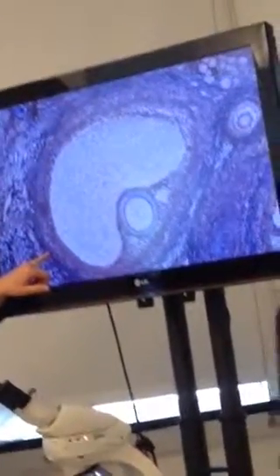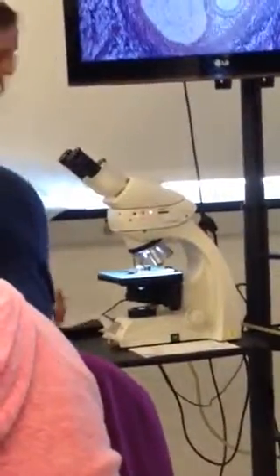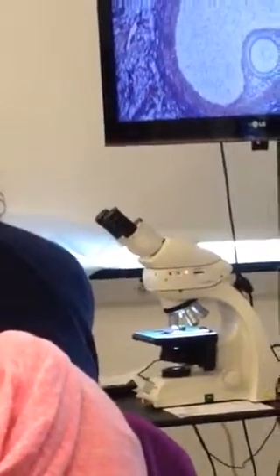Let's see where I left off. Okay. So I'll leave this up here. If you want to go back to a different part of the slide, let me know and I'll put it back. But I'll leave this for you to take a picture. Sperm. Well, I'll put the sperm up in a few minutes, or should I just do it now? No. I can put this back.